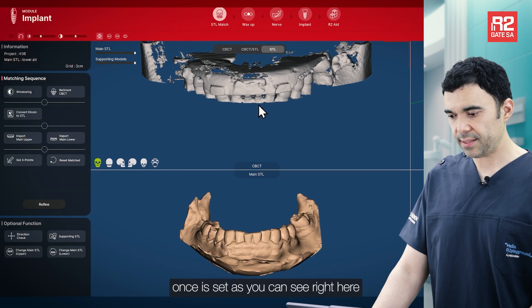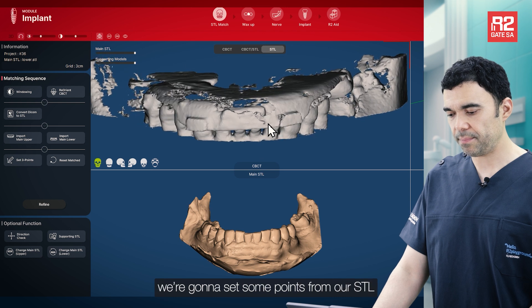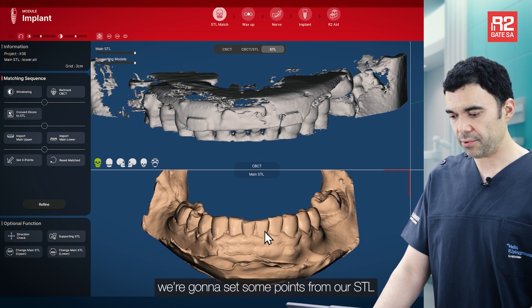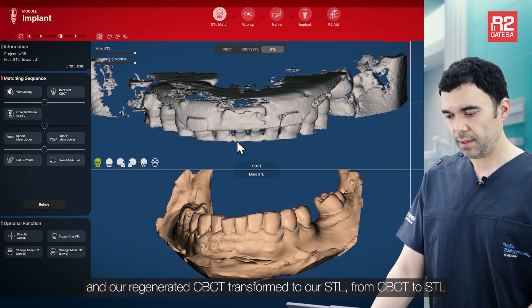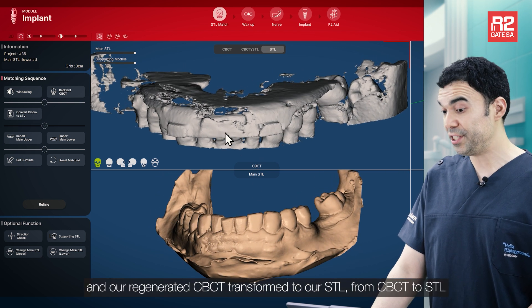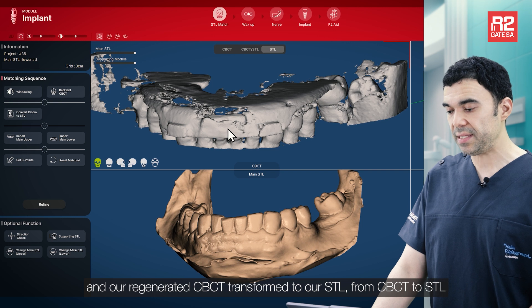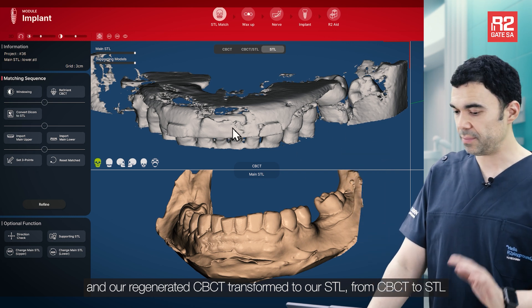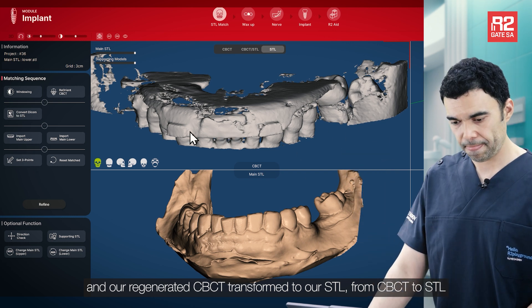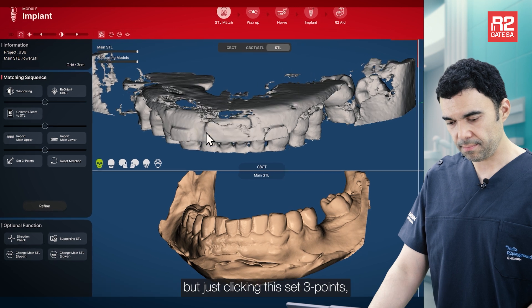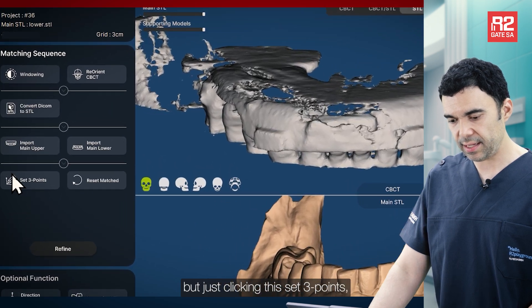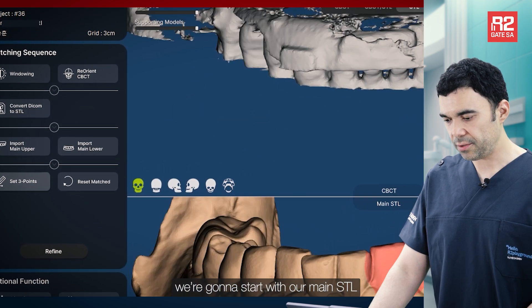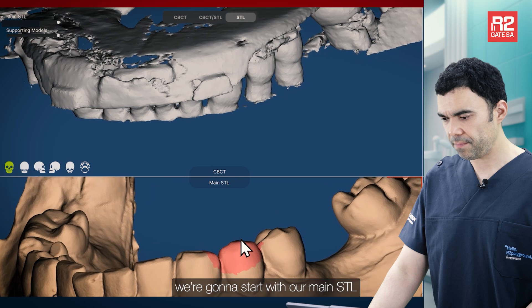Once it is set, as you can see right here, we are going to set some points from our STL and our regenerated CBCT transformed to STL. By just clicking Set Three Points, we are going to start with our main STL.